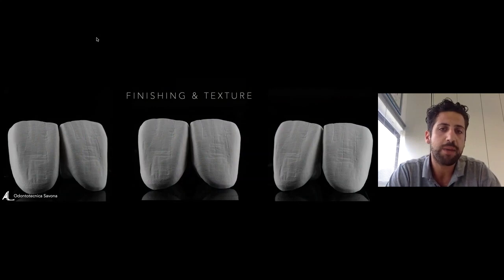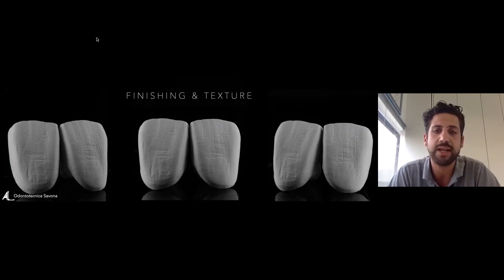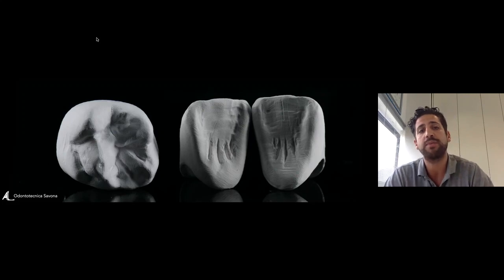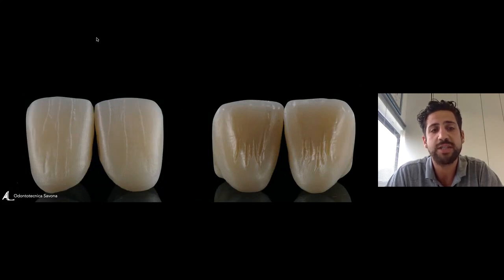Now we go to speak a little bit about Dispersive, okay? It's really important in the Prettau 2 Dispersive, if you want to use this kind of zirconia full contour, the finishing and texture of the surface, because we are still in a full contour material. And also the infiltration, the effect after the sintering depends on the structure made before the sintering. And this is the result after the sintering, without putting any color, any blue effect, any cervical effect. Just put it in the furnace without any color.